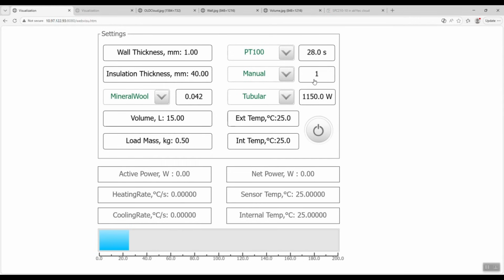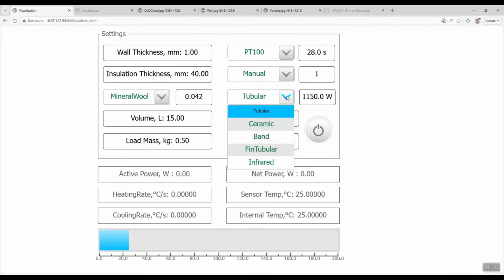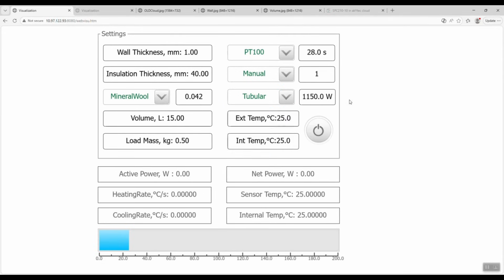We can select different types of heating elements, and for each type, we can also set the heater's power. The higher this parameter, the faster the sterilizer chamber heats up. The 9th parameter is the external room temperature, which is necessary for implementing a realistic physical model of the thermal balance.